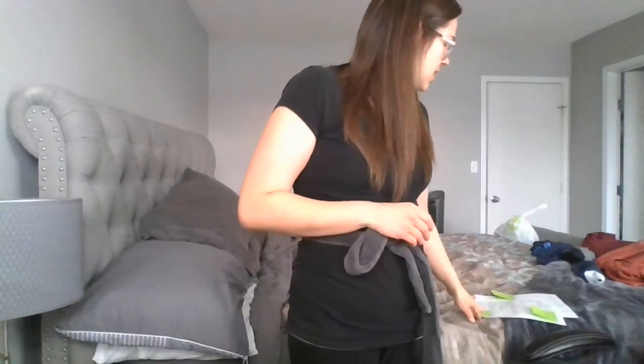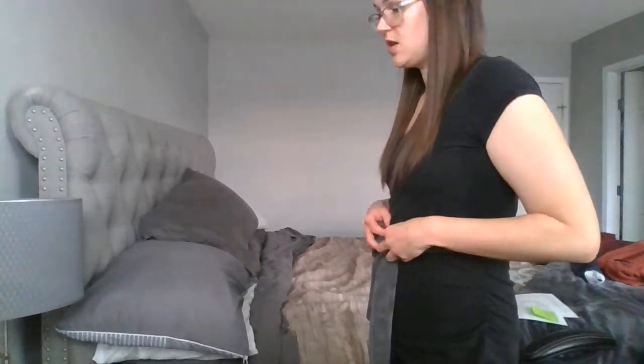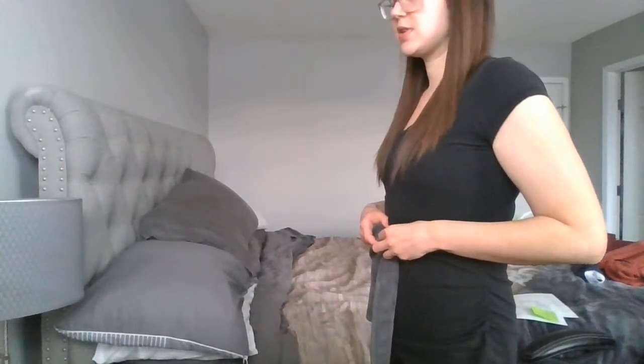So it would be 1, 2, 3, stand. So the group of three, everyone stands together, the two nurses working synchronously together to make sure that's nice and fluid. And then again, if we're going to pivot, we're going to go 1, 2, 3, pivot. We're going to move the patient, pivot, 1, 2, 3, sit, and then we're going to sit the patient.